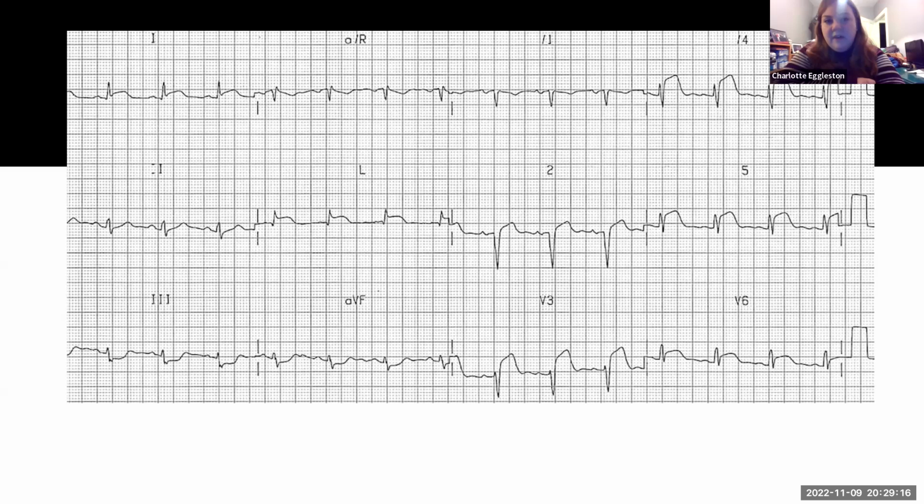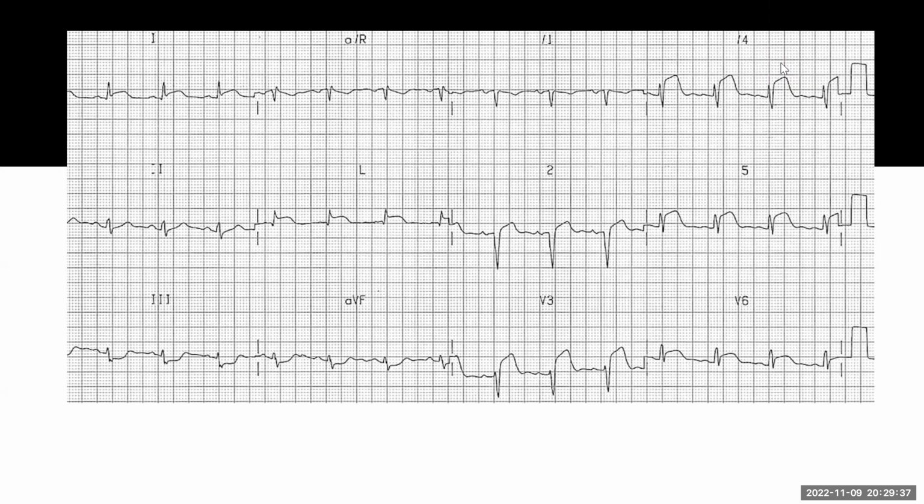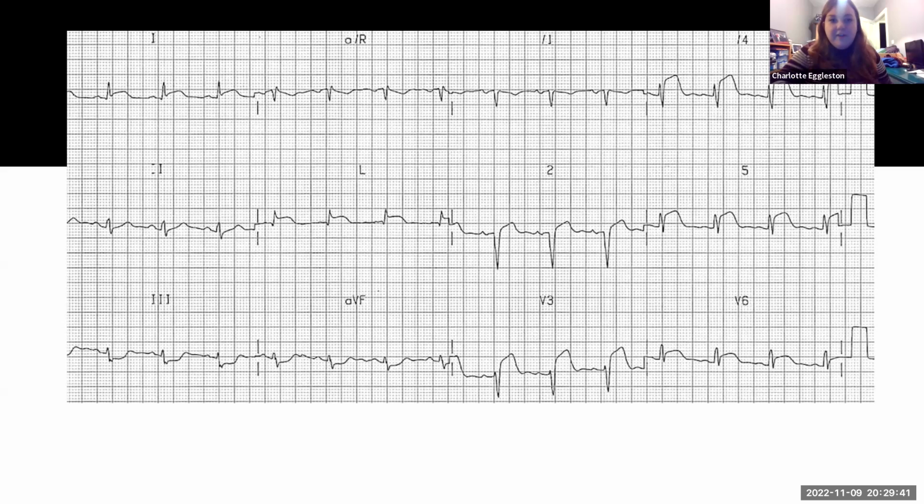So what sort of areas of the heart are we covering here? We've said V2 to V6, but then also 1 and AVL. And yeah, AVL. Didn't quite catch that. The lateral one? Anterolateral, yeah. I think the first person was a bit quiet, so I didn't quite hear that, but yeah, anterolateral.